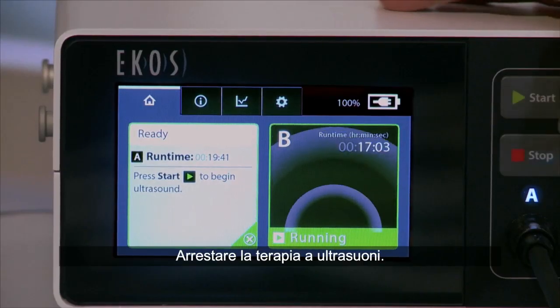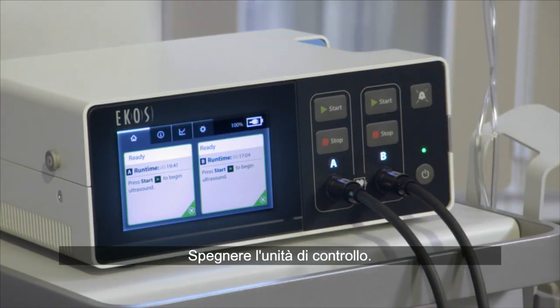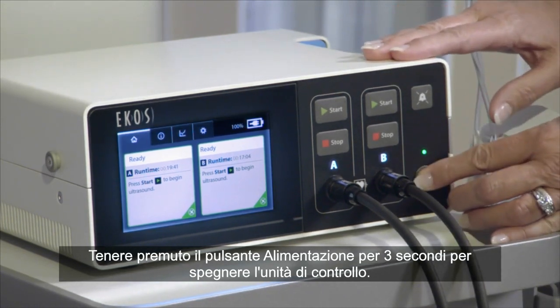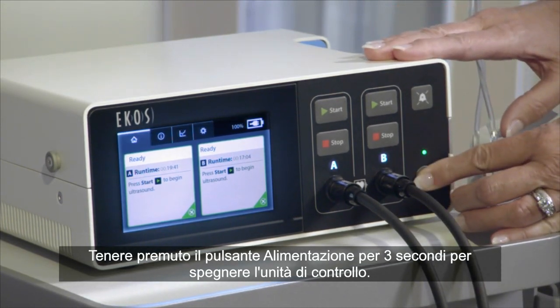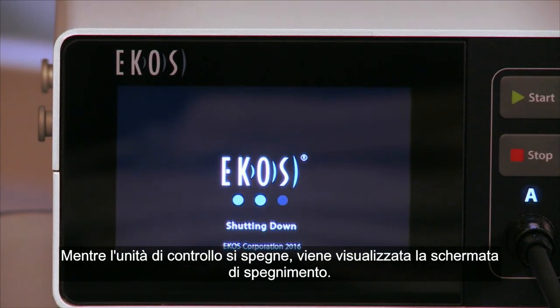Stop ultrasound therapy. Press the Stop button on the control unit for the appropriate channel. Turn off the control unit. Press and hold the power button for 3 seconds to turn off the control unit. The shutdown screen displays as the control unit shuts down.